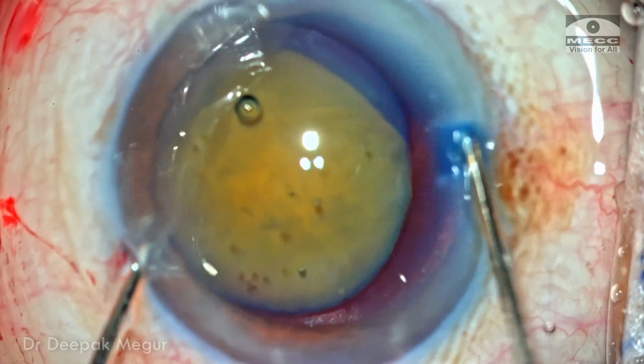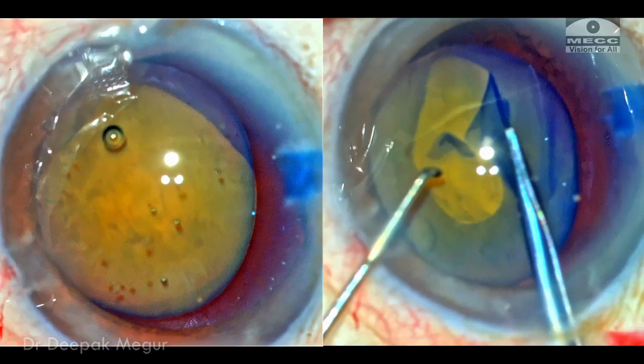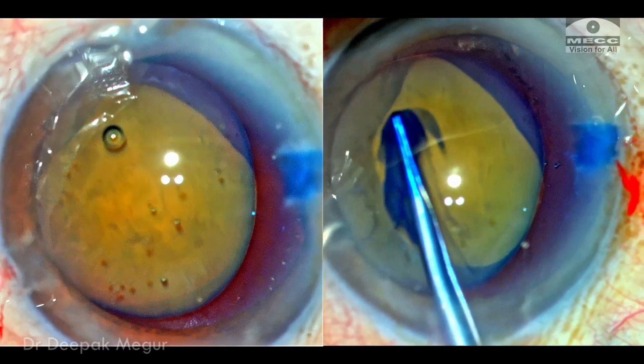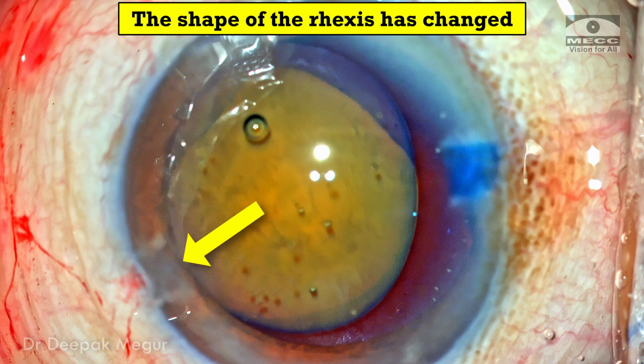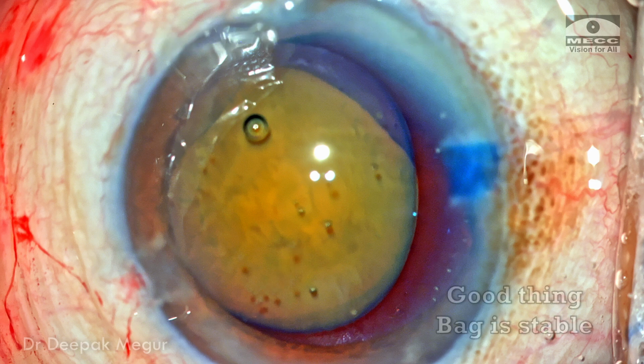But there's a thing to note here. You can see that the shape of the rhexis has changed now. Because initially the bag was in a collapsed state, the rhexis was in a different shape. The rhexis was looking a different way. But now with the bag being stretched by the CTR, the rhexis shape has changed and the margin on my left side has gone under the pupil now. But nevertheless, the good thing is the bag is very stable so that I can go ahead and perform the emulsification of the nucleus in a much safer way.